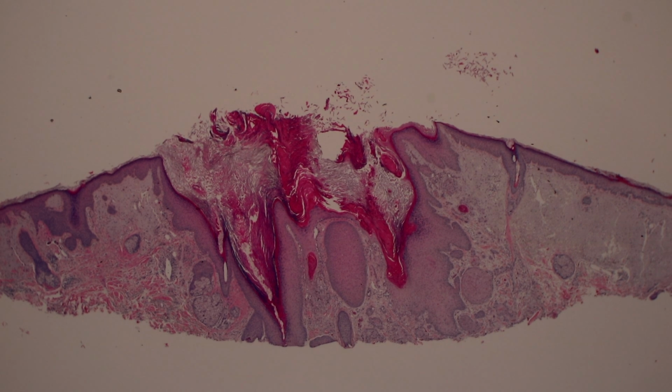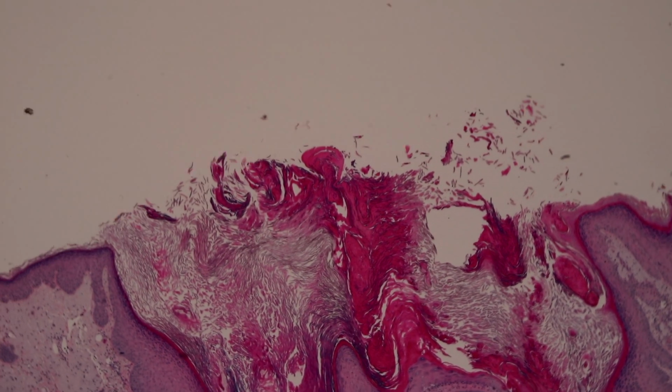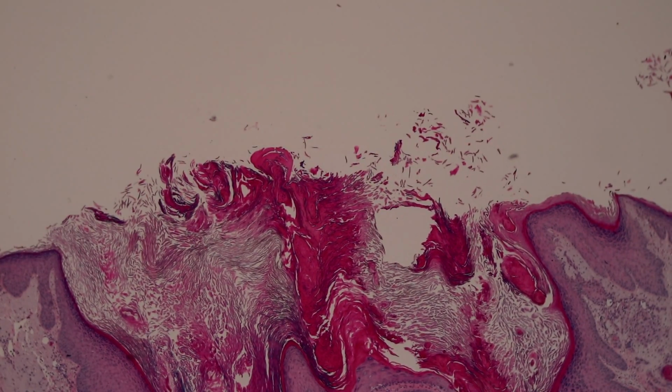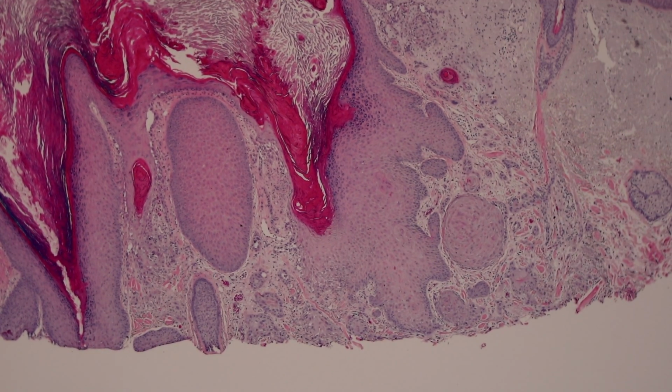And then here's an example of this very open cystic change that you can have at the top of a squame. So again, what if we just had this biopsy? You might say, oh, it's the opening of a cyst or a dilated follicle. It's got loose, flaky keratin in it. It doesn't have any atypia really. But then if you go down below it, ta-da, squamous cell carcinoma.